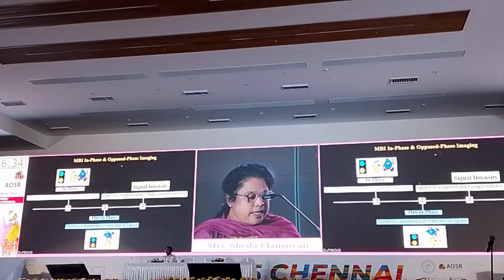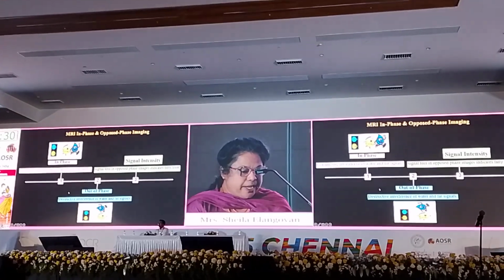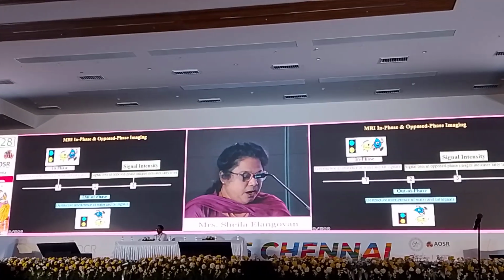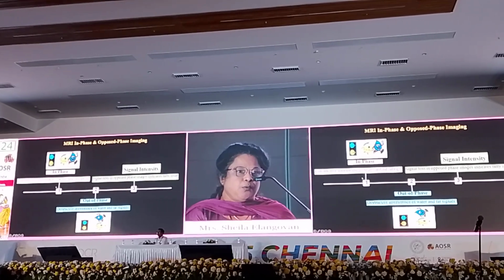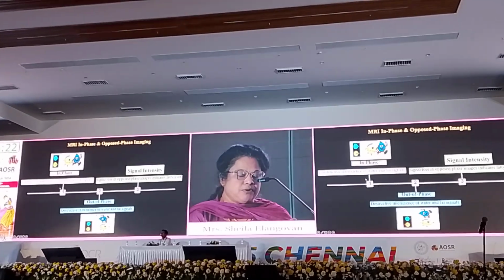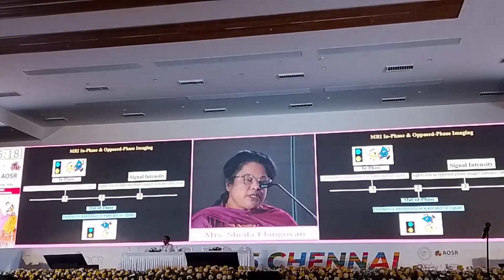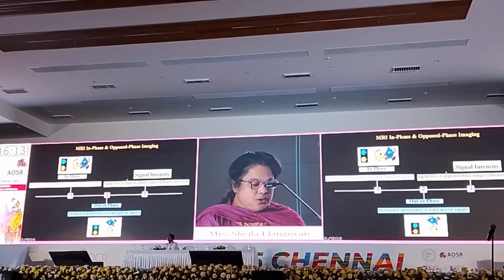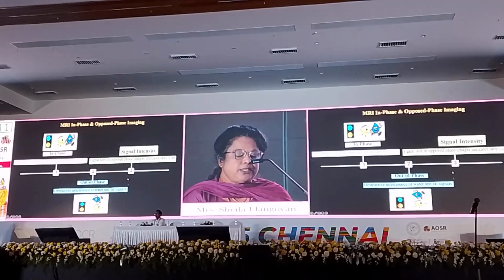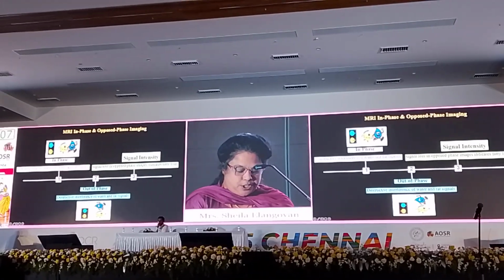So next, if you know the in-phase and opposed-phase images that we routinely do, it is based on the constructive interference of fat and water. When they are within a particular voxel, fat protons and water protons are in phase, and at times opposed by 180 degrees, that is, out of phase. So the total signal intensity when it's a fatty liver, you can see signal loss on opposed-phase images.